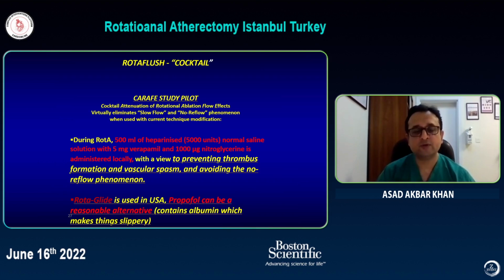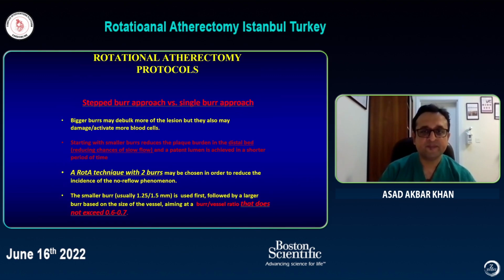So one solution to that is using propofol 1 to 2 cc in the heparinized saline, which contains the same or similar amount of albumin and helps make things slippery.